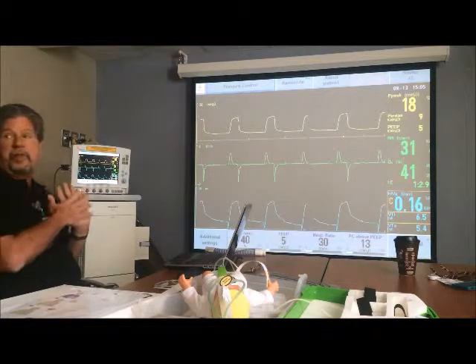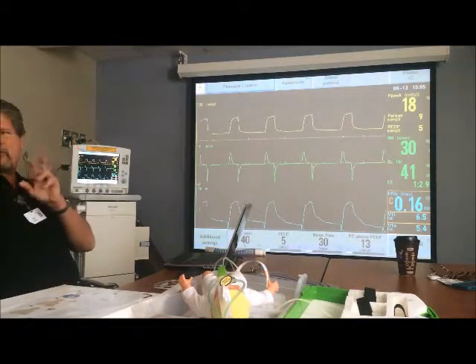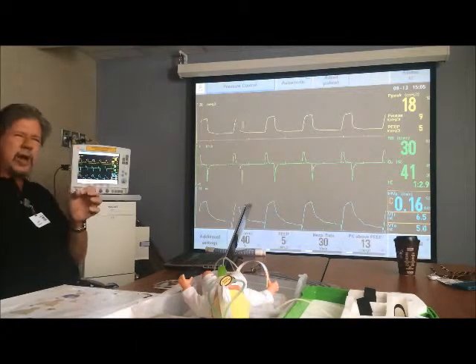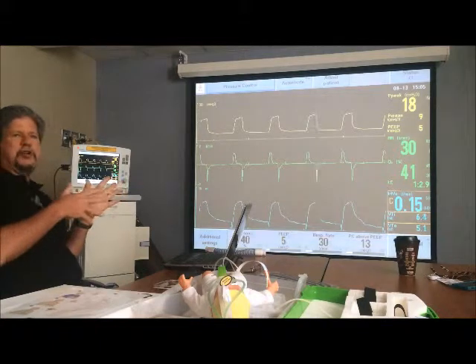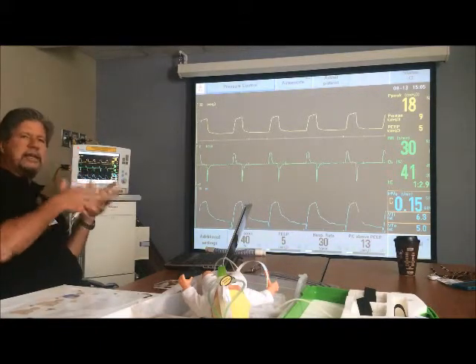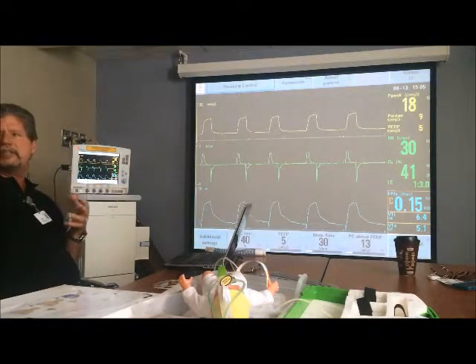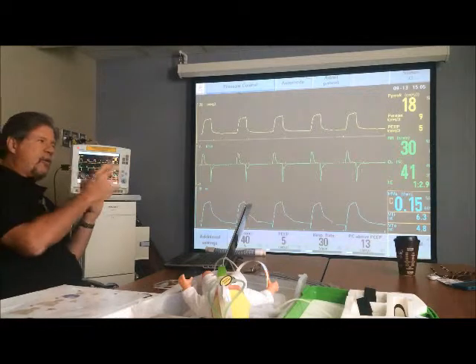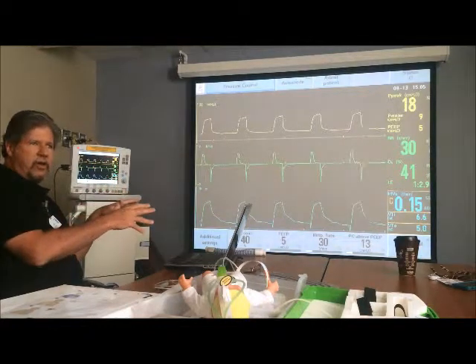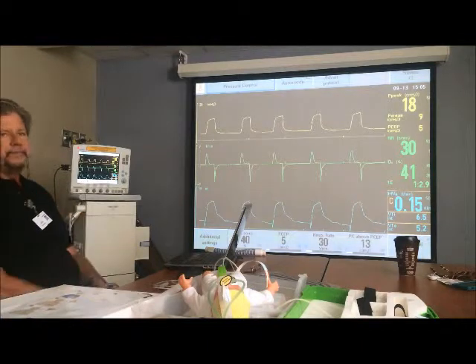You don't have to keep them in the NAVA mode. And sometimes, even if they're in the NAVA mode, if you're wondering what's going on with NAVA, it doesn't look quite right, and you guys might have done this in the PICU, well, let's just put them back to pressure support for a minute. See what he does in pressure support, if he's giving us the same problems that he gives us when he's in NAVA. And you might have different ones, but at least, okay, now we're back to what we know and see how he's ventilating, and then we can go back to NAVA.